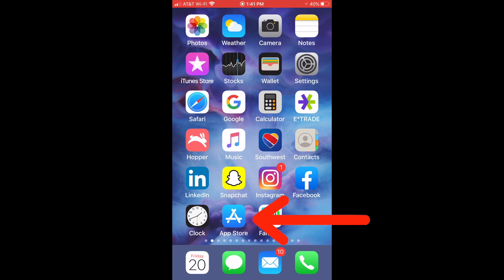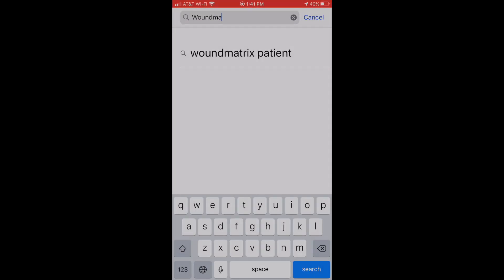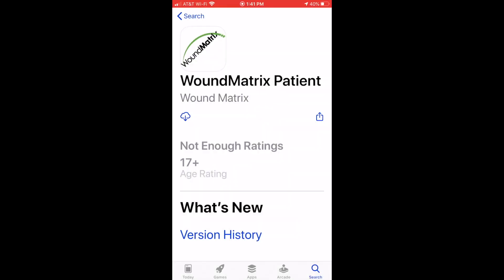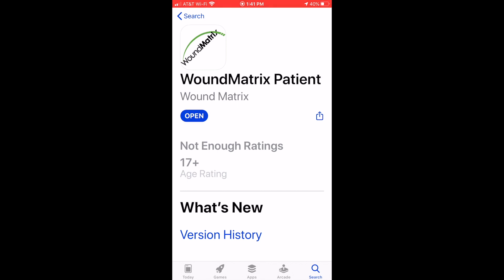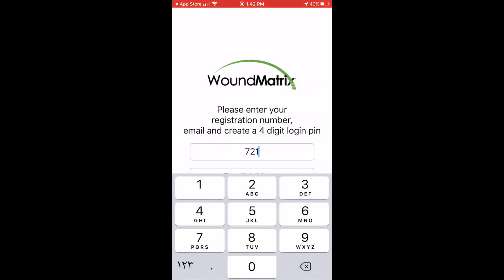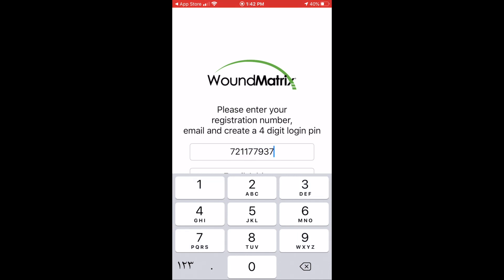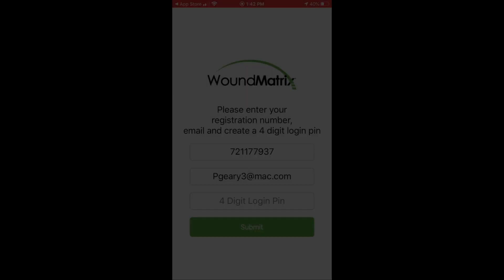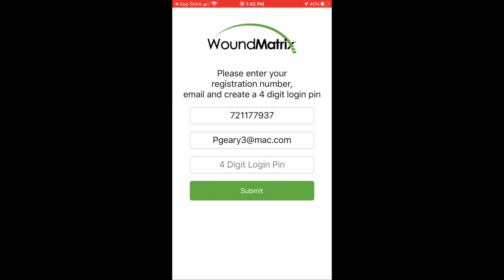Go to the App Store on your mobile device and search for the Wound Matrix Patient app. Download the app to your phone. Enter the 9-digit registration number given to you by your provider. Also enter your email and create a unique 4-digit PIN.